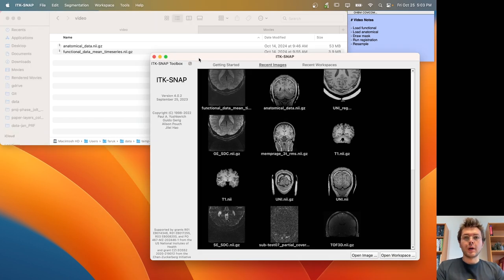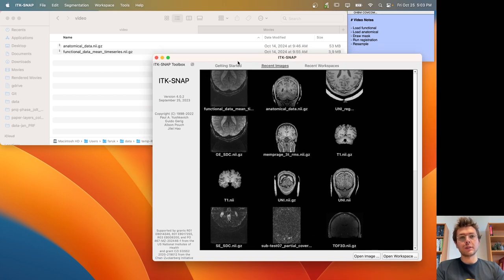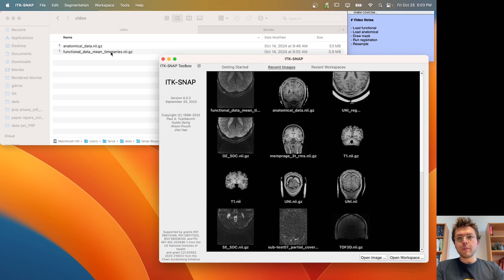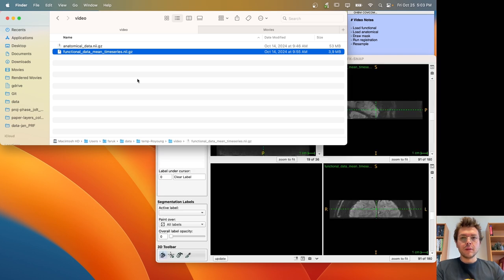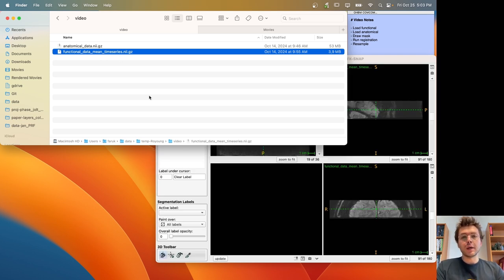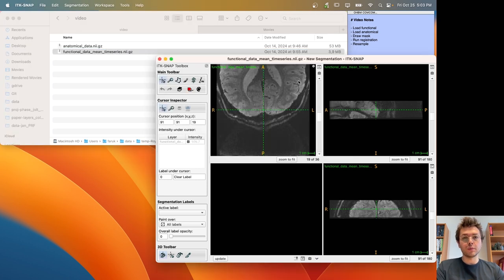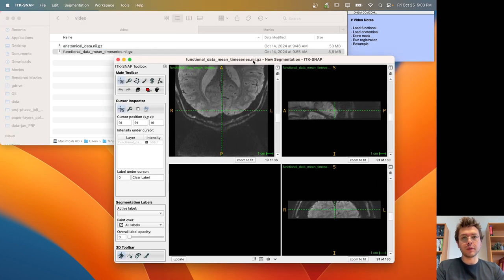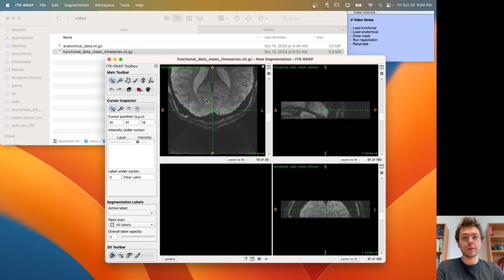First, I am going to use ITK-SNAP to demonstrate this registration method. I am going to load my functional data. This is the data that was sent to me by Royang, and that is the mean time series, which means that all the four-dimensional data is compressed into three dimensions by taking the average across the time series.